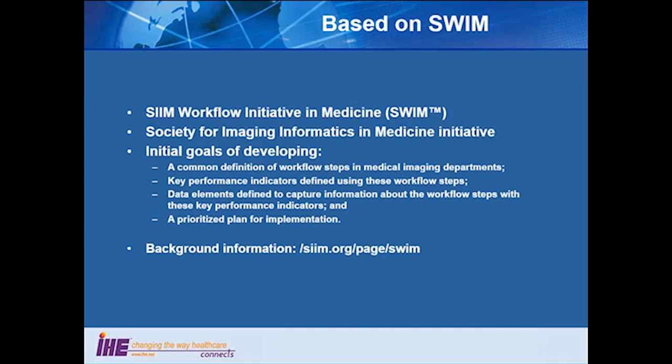They wanted a common definition of the steps, not unique to any particular vendor. They wanted indicators that are useful, the key indicators, defined the data elements to capture the useful information, and they prioritized what should be measured first.